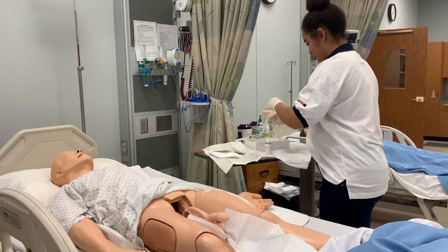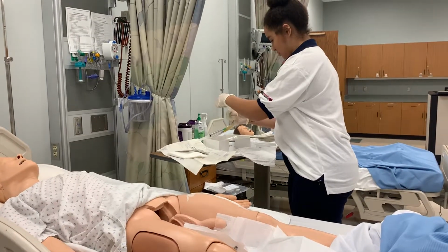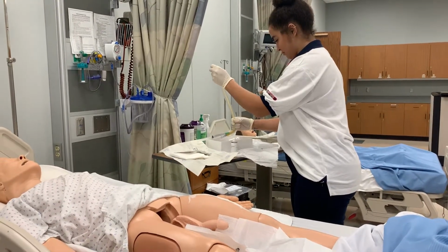Going to coil this around my finger, probably take this packaging off.